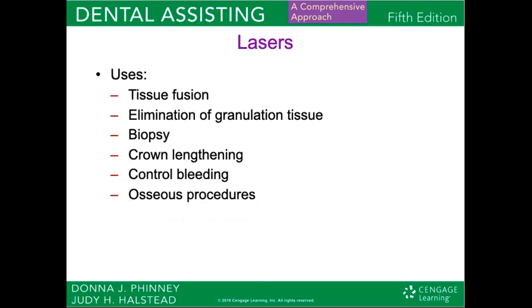And that's not all. They can also be used for tissue fusion, or elimination of granulation tissue, which is just dead gum tissue. They can be used for biopsy reasons, for crown lengthening, and we'll talk more about crown lengthening when we get into the crown procedure. And lasers also control bleeding as well as osseous procedures.